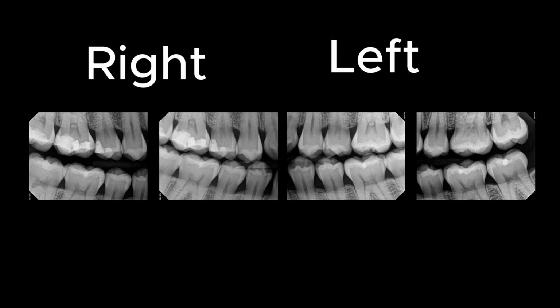If you look at the left one, they did a good job of opening the contacts. They got the bone levels, but they didn't quite get that mandibular canine in the image too much.